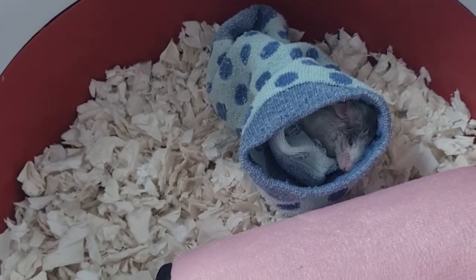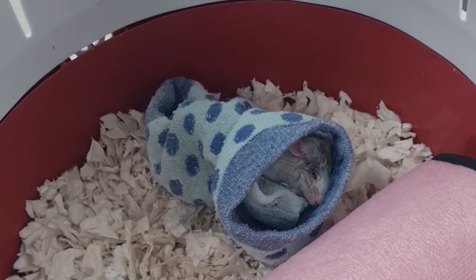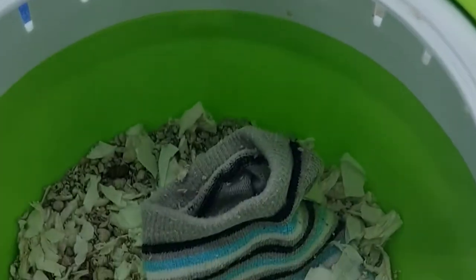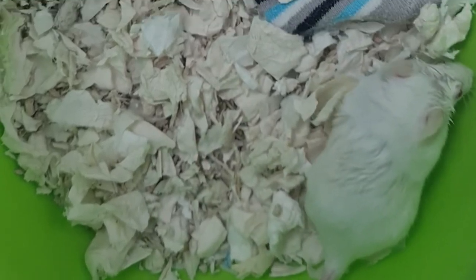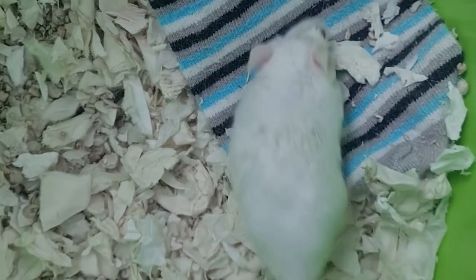One little waking-up mouse in a sock — because where else would you put your mouse to keep him warm? He's actually got warmer during his op than cooler. And here's his brother who was finished about 20 minutes ago, who doesn't like his sock and is ready for his hide and the rest of his bedding to go back in. Apart from the lube around his eyes, his cataracts have totally resolved — and apart from the lube on his eyes, you would have no idea that he's had anything done to him.